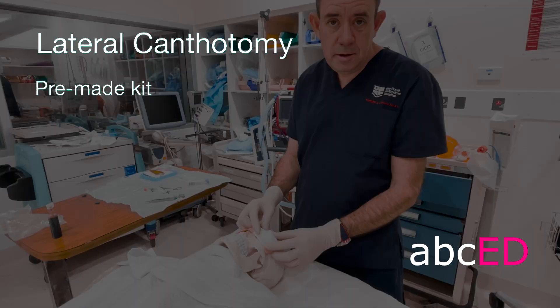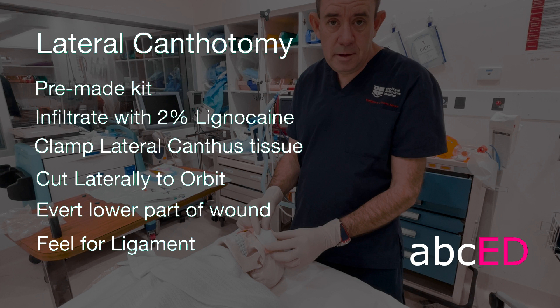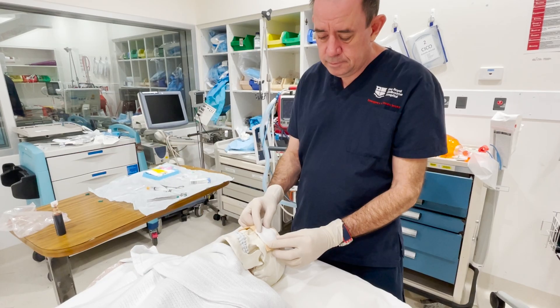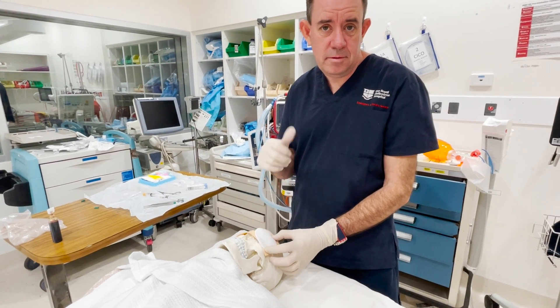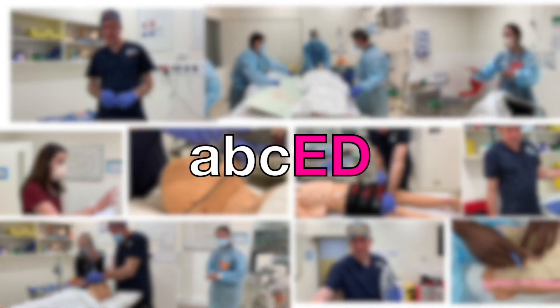Lateral canthotomy: use a pre-made kit, infiltrate with 2% lidocaine, clamp the lateral canthus tissue and cut laterally towards the orbit, evert the lower part of the wound so you can feel for the ligament, and then cut the ligament. And that's a lateral canthotomy. Thank you.